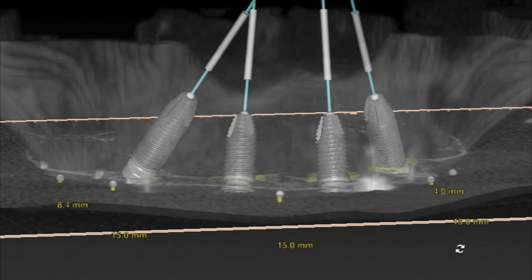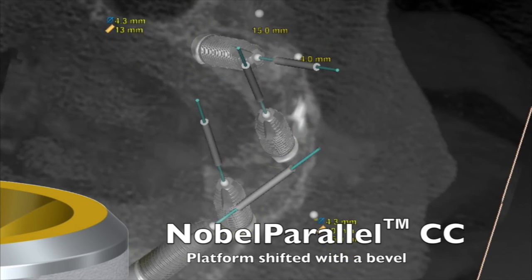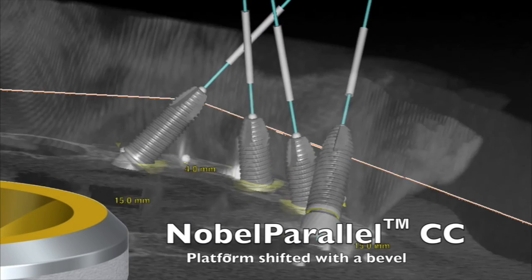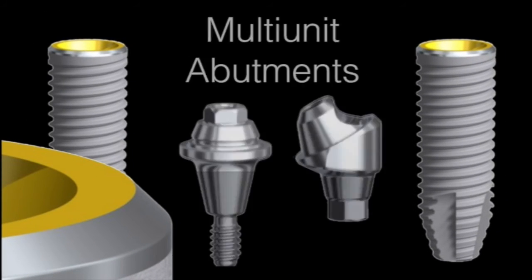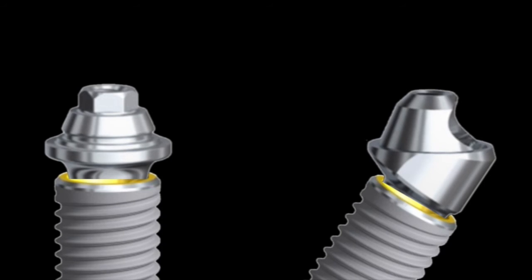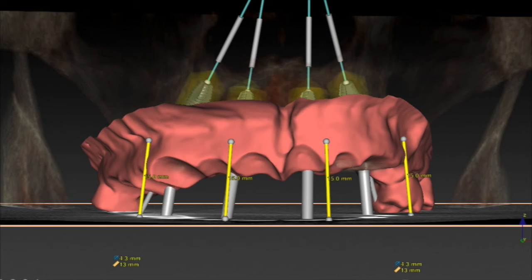If we turn off the patient model we can see the position of the implants based on the angulation being about 30 degrees. We can see the Nobel Parallel CC implant, which is going to provide extra soft tissue around the top of the implant especially when the multi-units go on. You can see the yellow platform shift on top of the implant and also the 45-degree bevel, so when the multi-units go on you get this platform shift effect that enables you to keep a little bit more soft tissue, stabilizing and sealing the implant better.